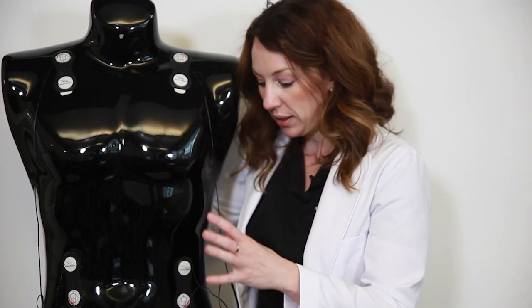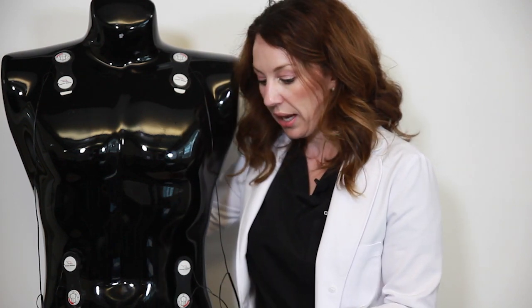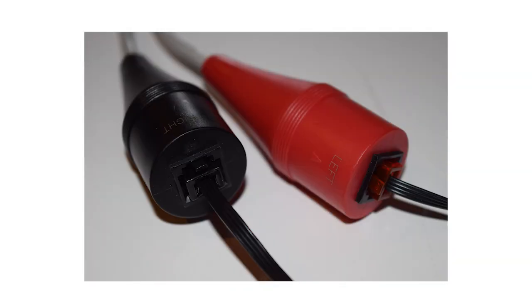So in summary, here we are. We have 2 sensors above the heart. We have 2 sensors below the heart. We have good, clean, dry, intact skin. And then we plug the sensors into the patient cable, red to red, black to black, and then we can hit start.